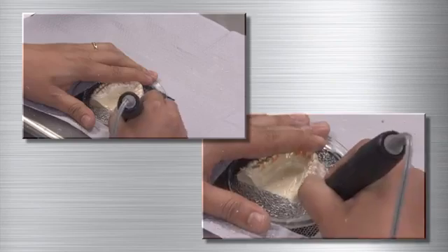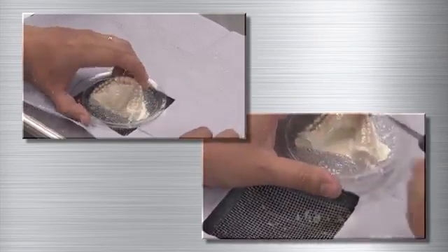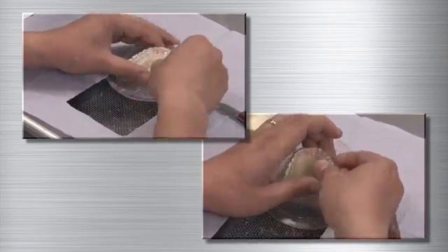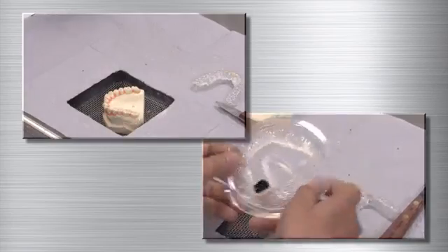When your initial cut is complete, cut a line from the back molar to the edge of the disc. Using a plaster knife, gently pry the device off of the model. Some teeth on the model will break during this process. Then, spread the remaining formed material from the model and allow the model to fall out of the foil.